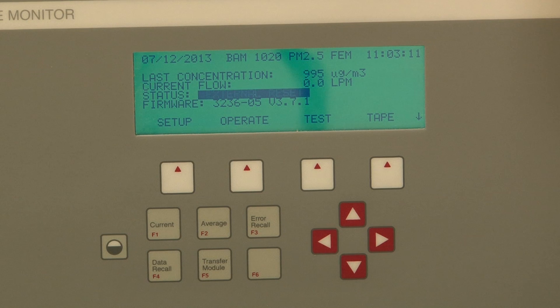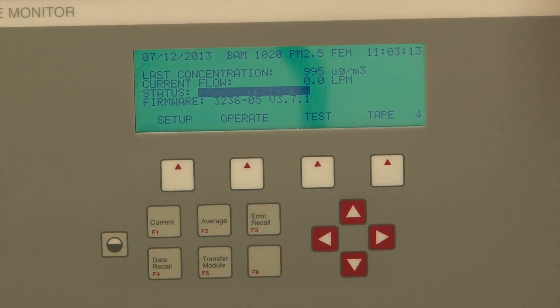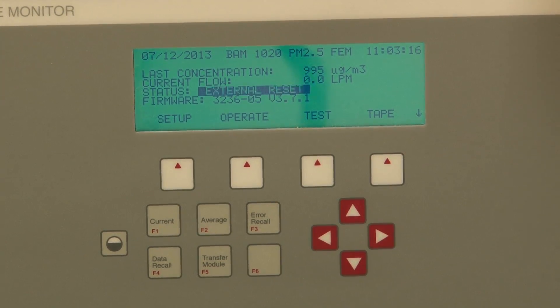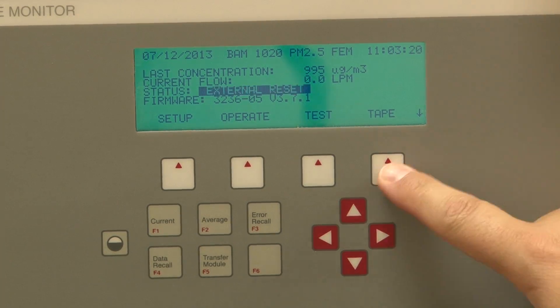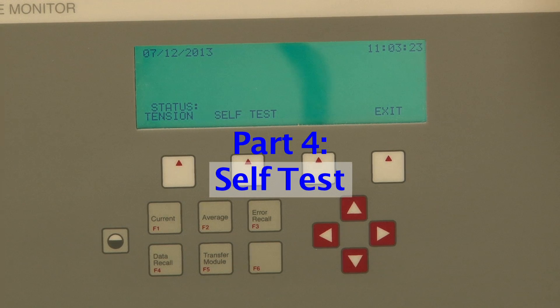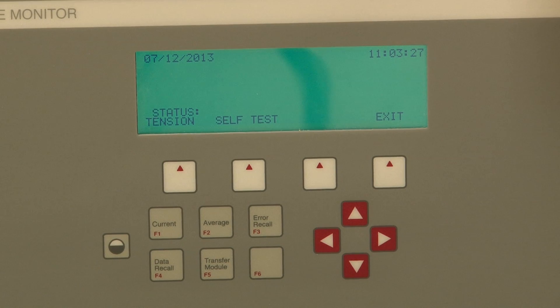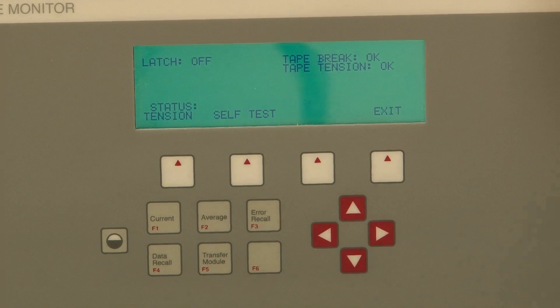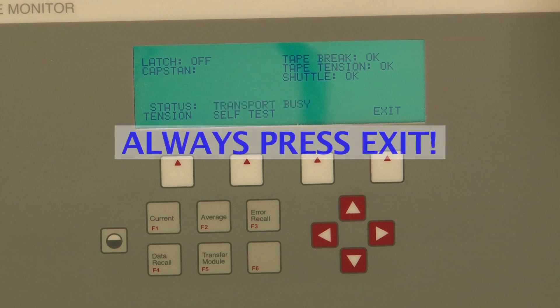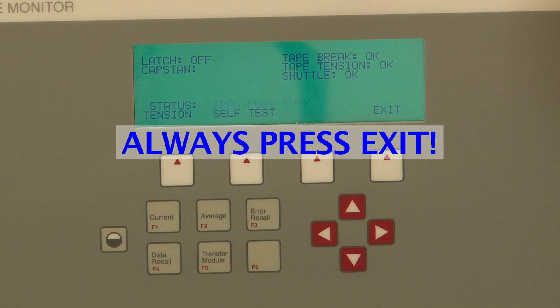From there, once you've gotten to this point, you do a final leak check — make sure that everything is good — then do the self-test. From there, you've calibrated the BAM. Then you run the self-test — it's going to run all the different procedures. Once you're done, you hit the Exit button. Always hit the Exit button; otherwise, you will not sample until you hit Exit.